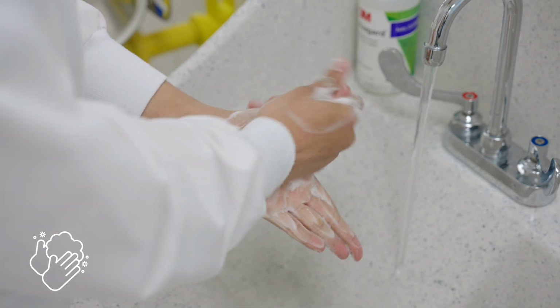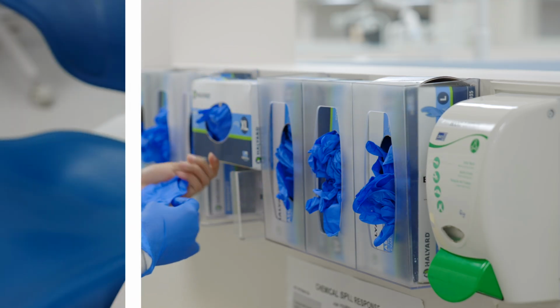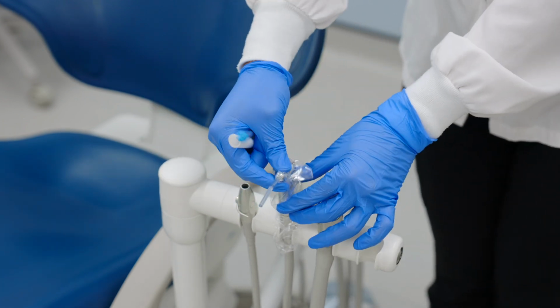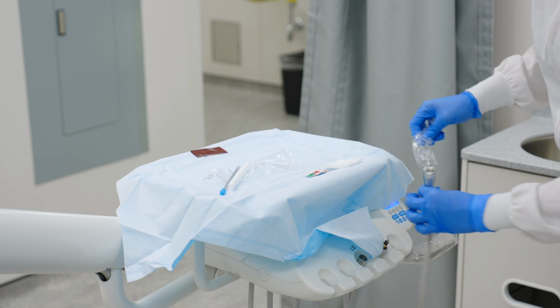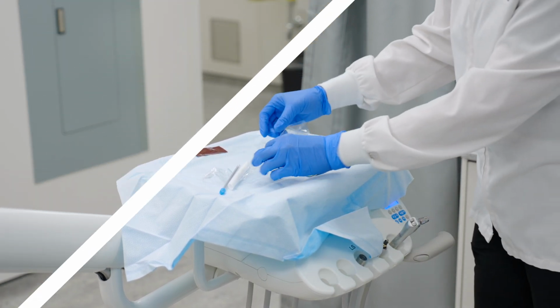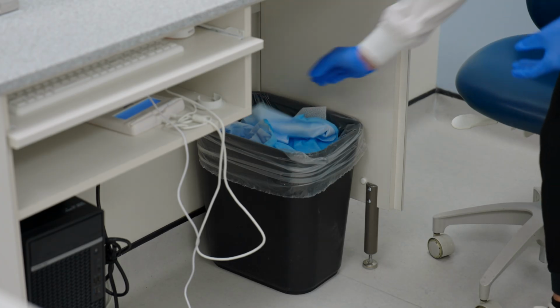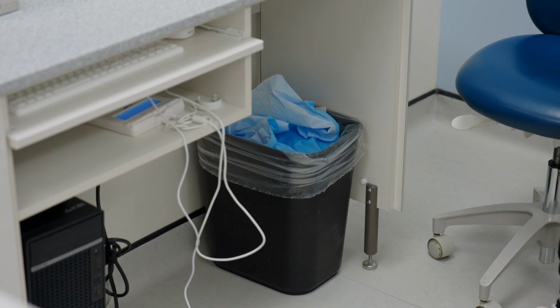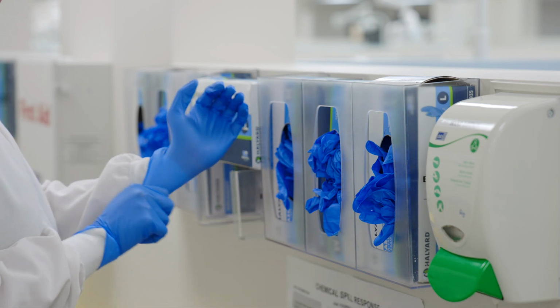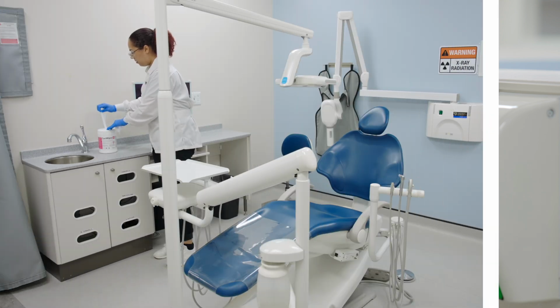Once hand hygiene has been performed, don a new pair of gloves and proceed with cleaning the cubicle. Start by removing all barriers and suction tips and place on the blue wrap. Gather any remaining single-use items and place on the blue wrap. Bundle your items with the blue wrap and discard into the trash. Once the bundle has been disposed of, doff your gloves and perform hand hygiene. Don a new pair of gloves. Now you can proceed to clean and disinfect the operatory as you did in the initial setup.